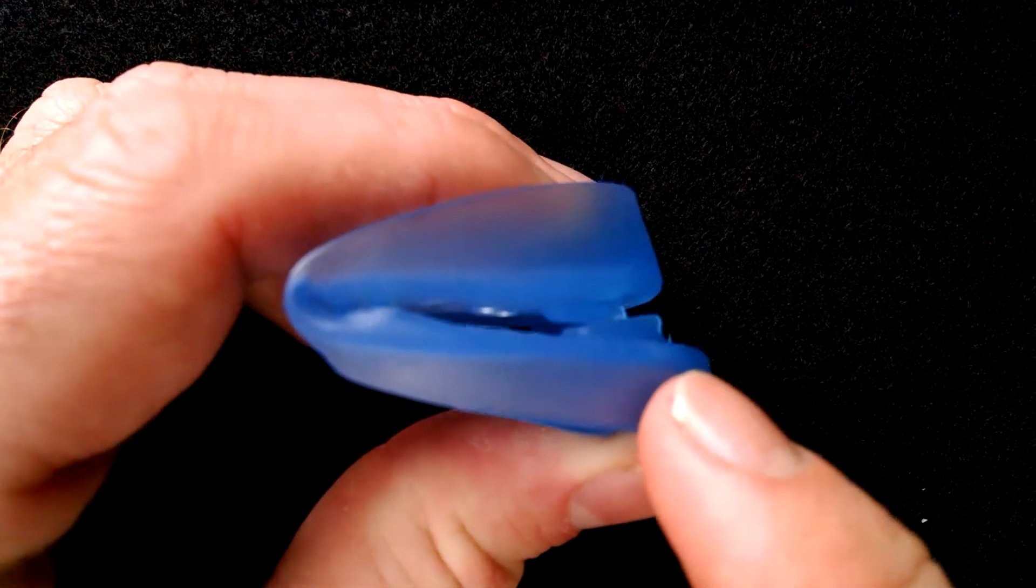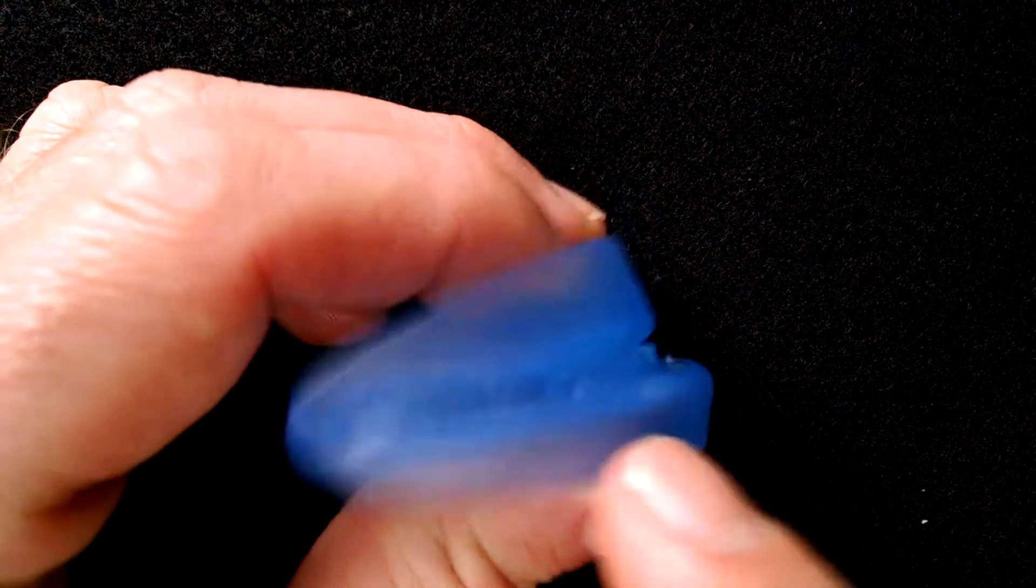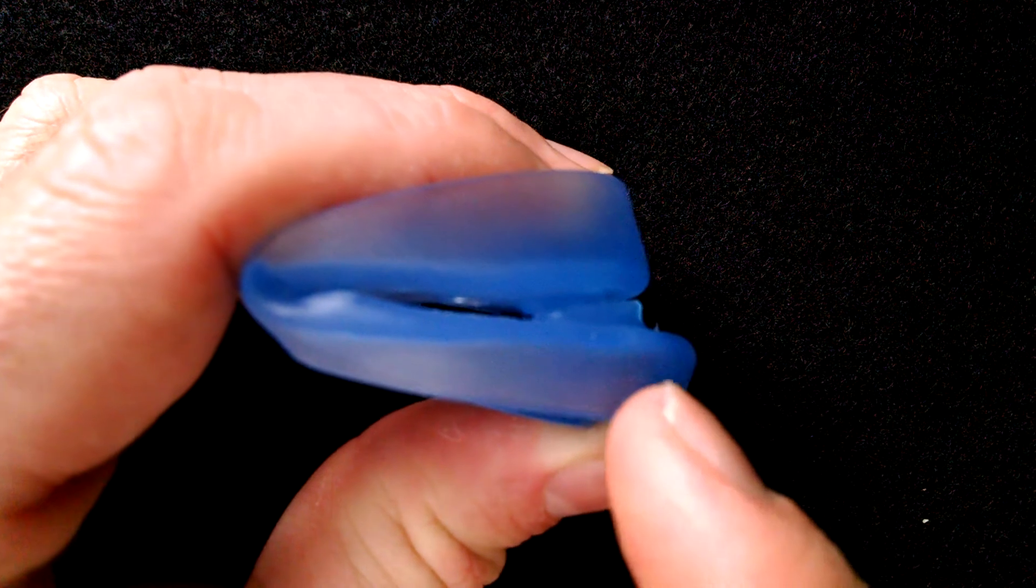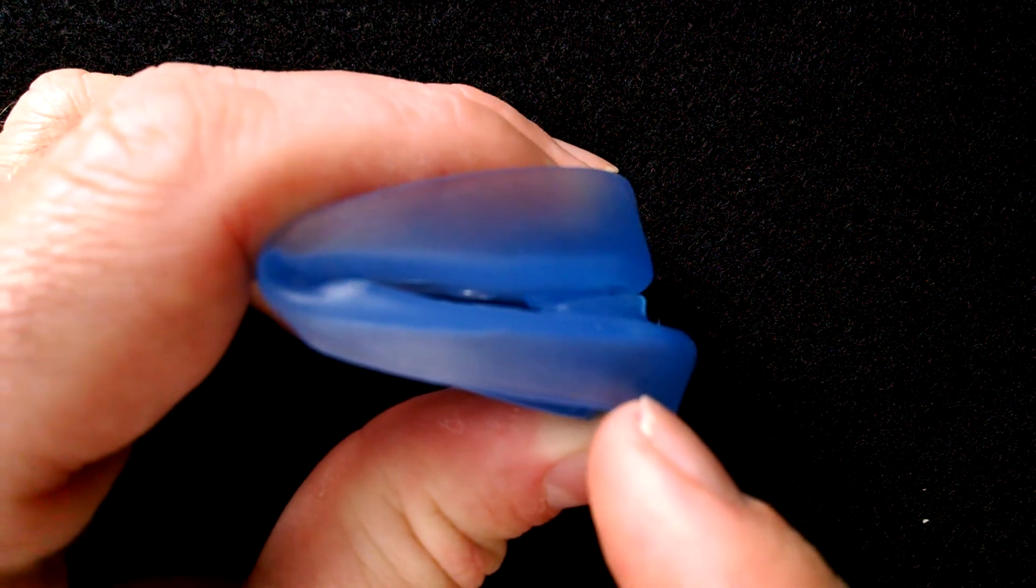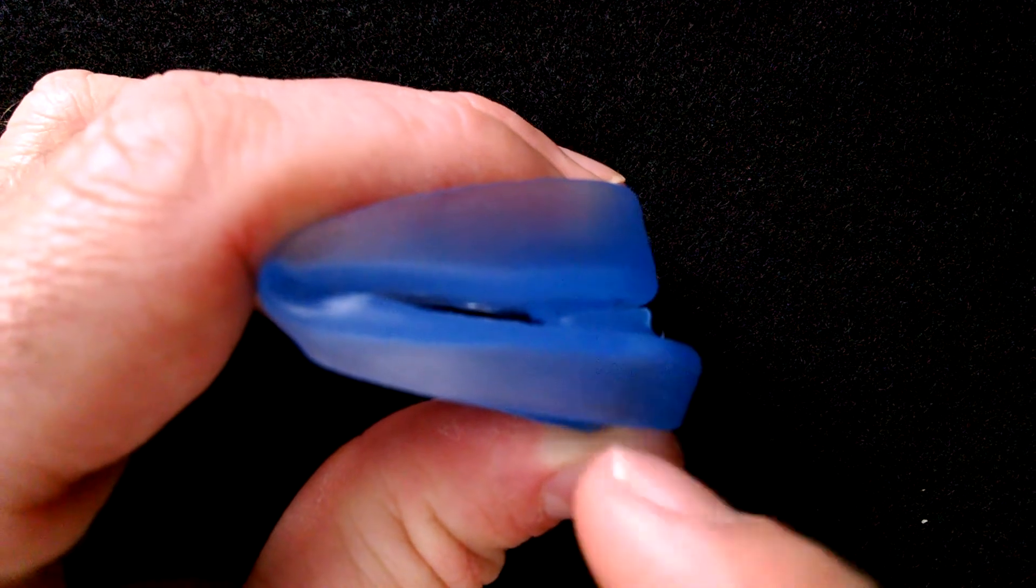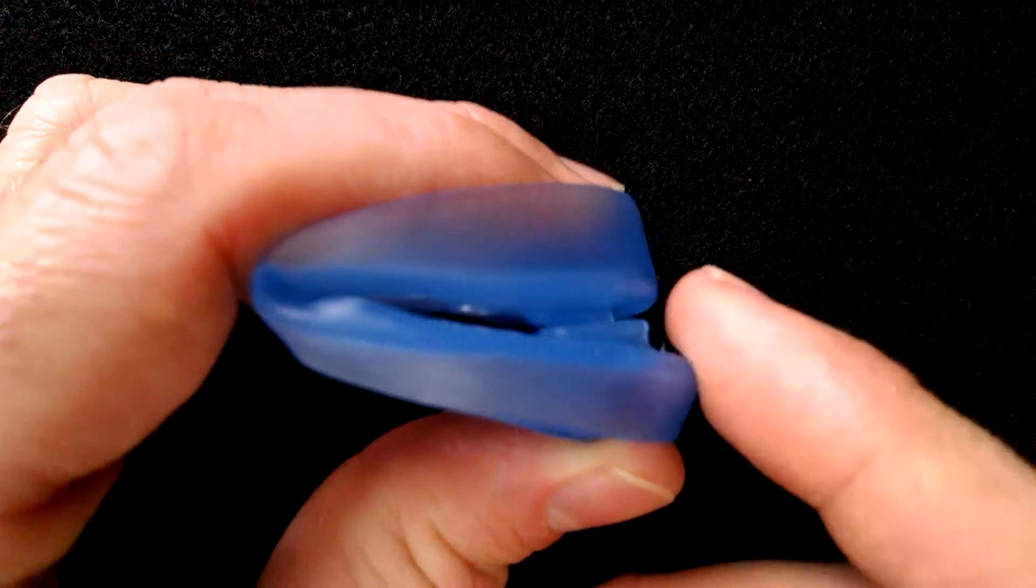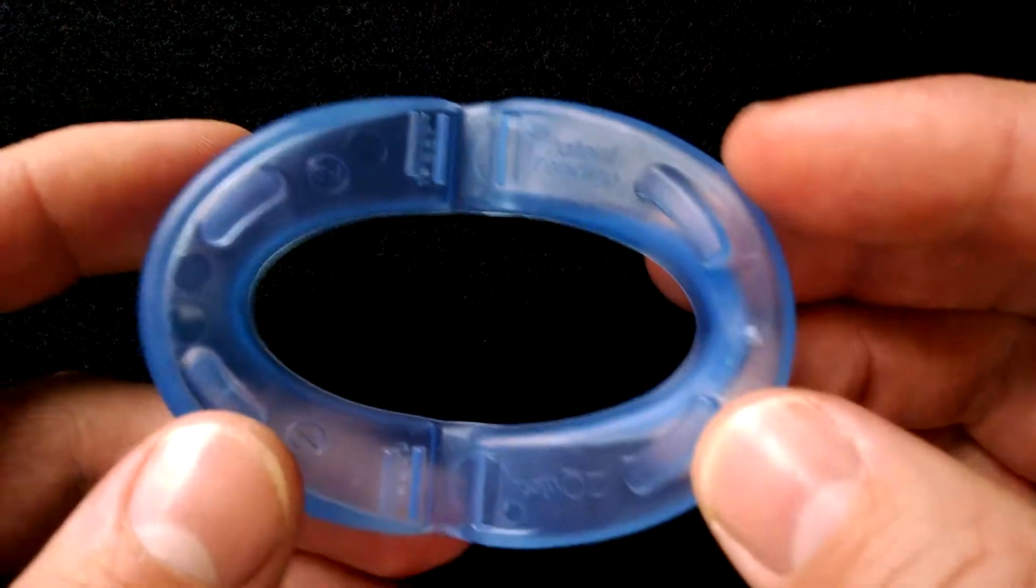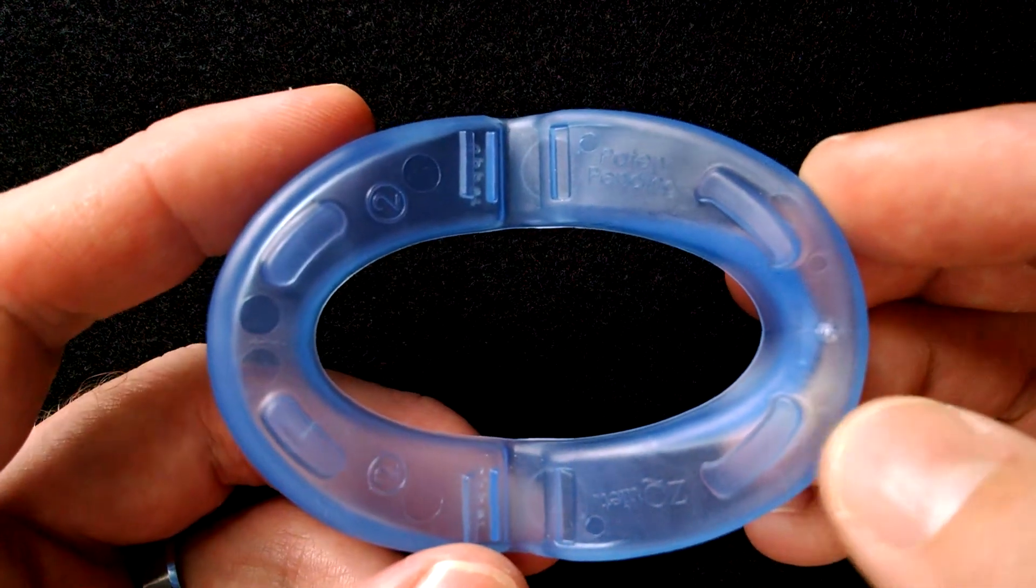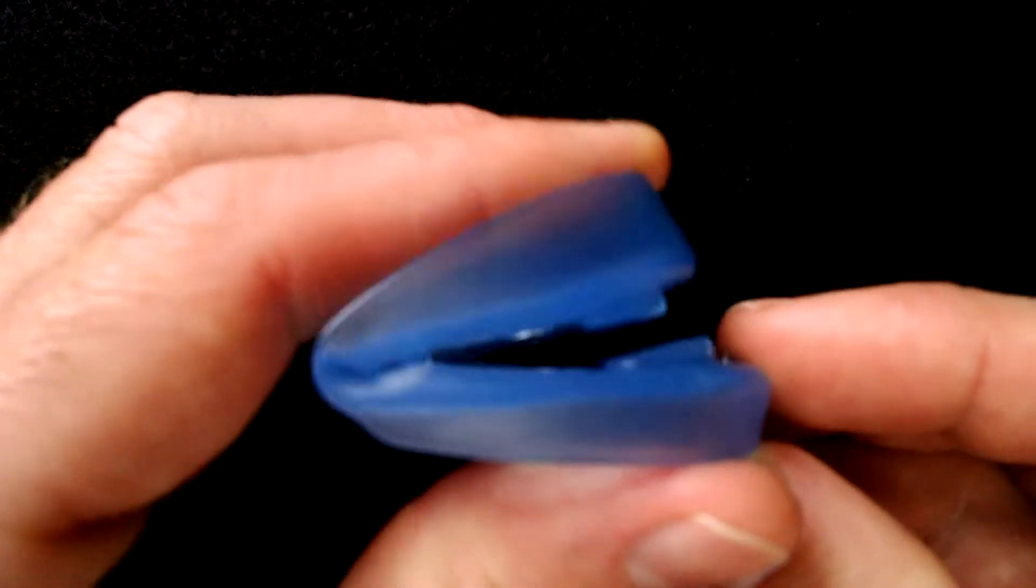When you buy the Z-Quiet it actually comes with two different mouthpieces, one with a further offset which is this one, and then the other one has less of an offset. So you're going to start with the one with less of an offset and if that doesn't stop the snoring then you move on to the second mouthpiece. So this is sort of a one-size-fits-all type mouthpiece ready to use straight out of the box and it has this unique hinge design.